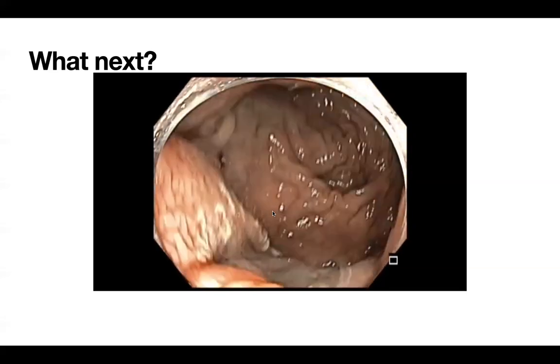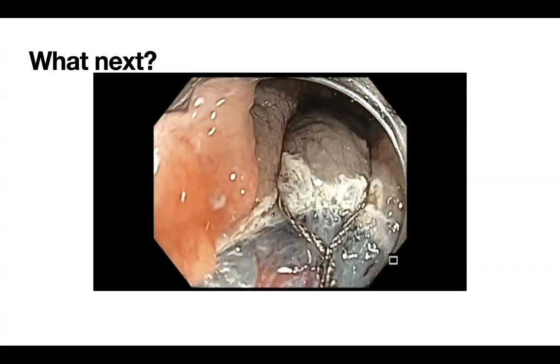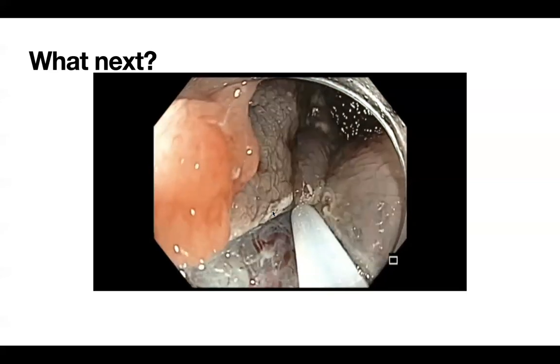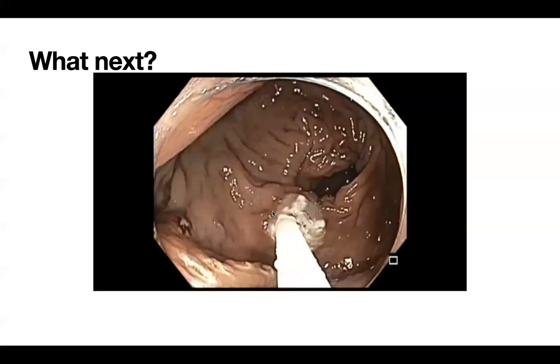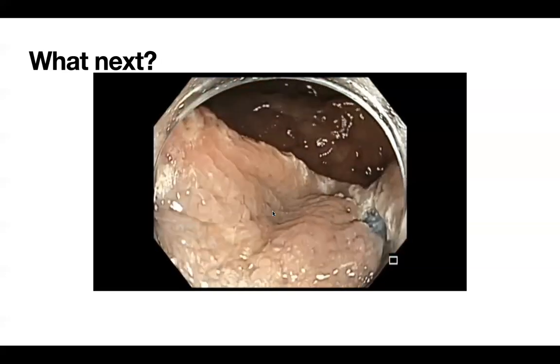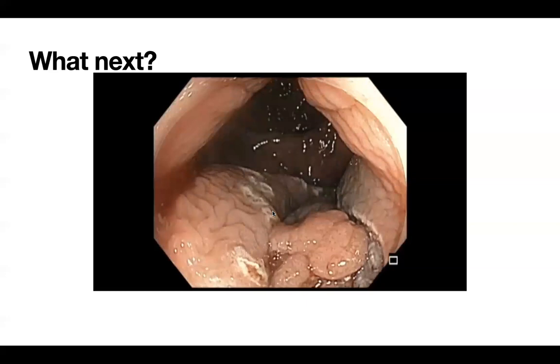I did not use EndoCut Q cut. I used force coagulation, 25 watts, effect 2, because of my concern about cutting over those hemorrhoidal veins, hoping that with the force coagulation there's going to be some coagulation effect and it is less likely to bleed.